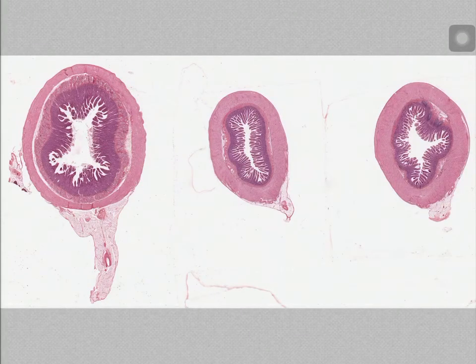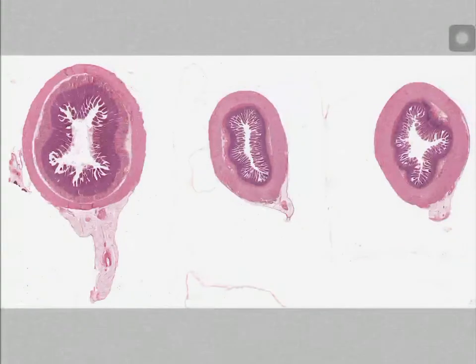Alright, so as we can see in this section right here, we have the small intestine. Now I know a lot of you guys have been having some issues with the small intestine, so we're just going to go over some defining features of each of the sections.